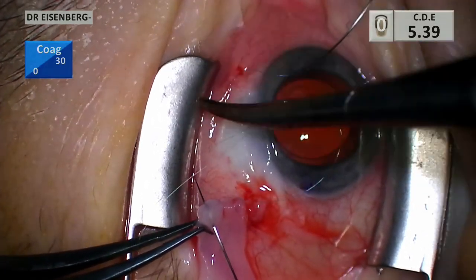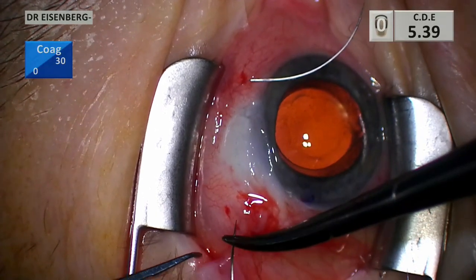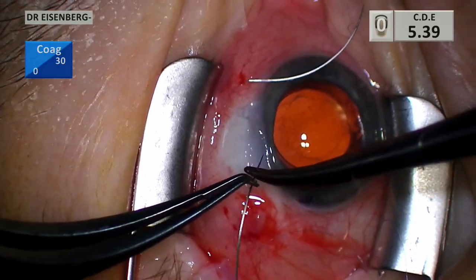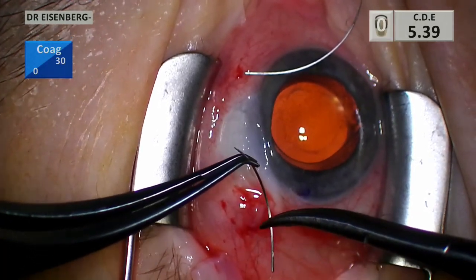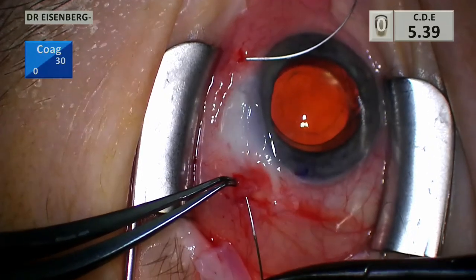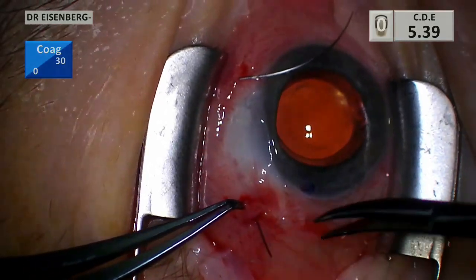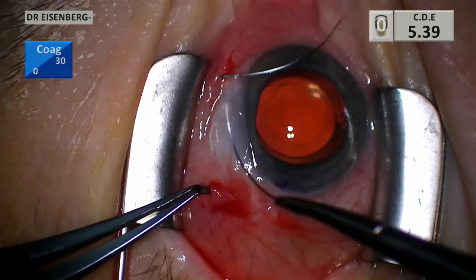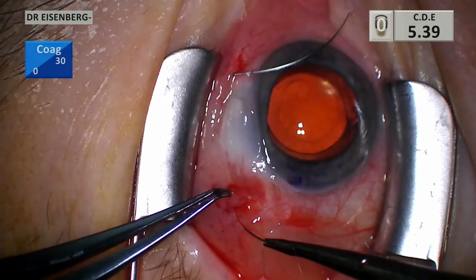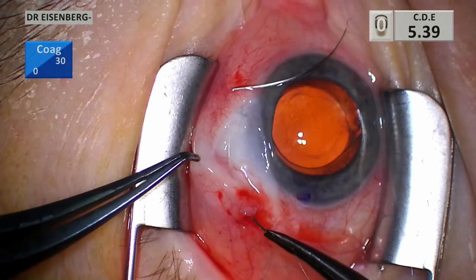Here we go — this is the second needle; you can see the first needle already through and hanging out waiting. I'm going to do the same kind of pass with the second needle: it's going to go under the bleb, not engage anything. I wiggle it back and forth as I'm going in to make sure I don't engage anything, because I need this suture to pull the material all the way across.